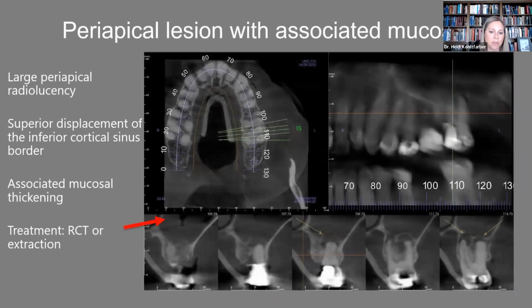All right, let's start with our dental alveolar. Certainly our periapical lesions, number one. I'm sure you have found a lot of incidental findings within the periapical region. I think that CBCT is in a fantastic place to help us better understand what's going on with our patients and to help educate our patients.